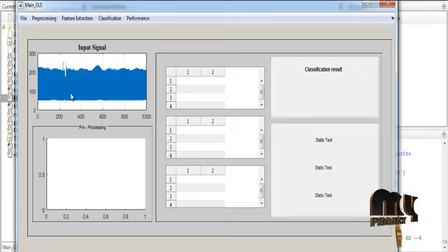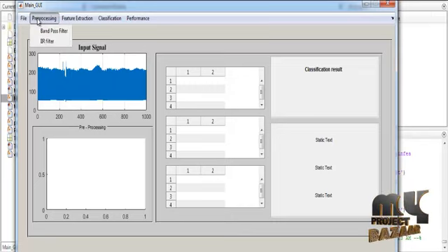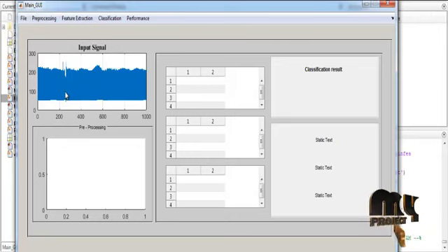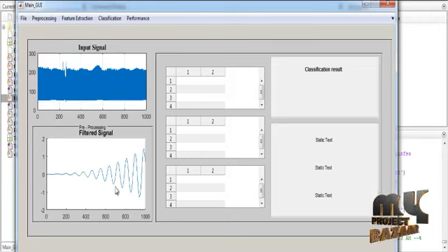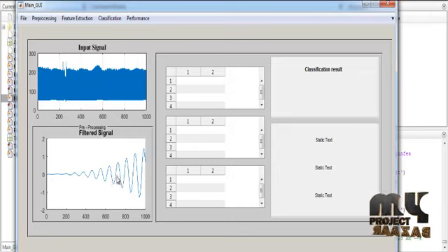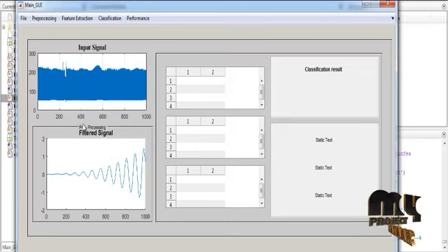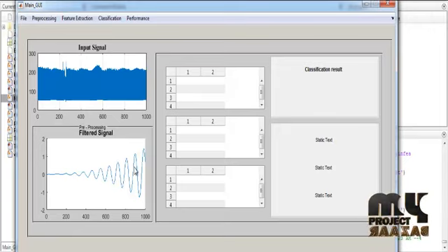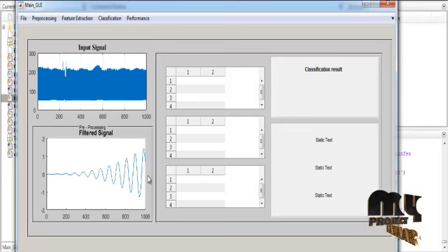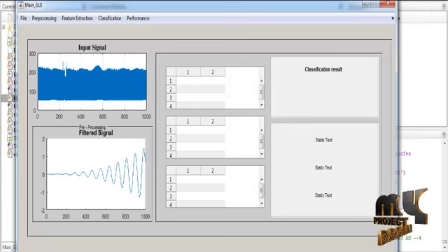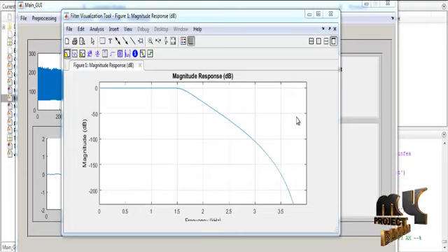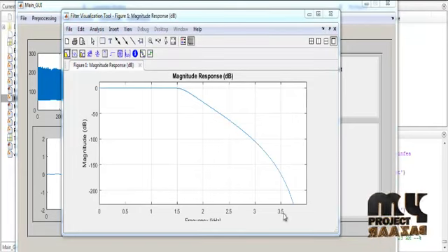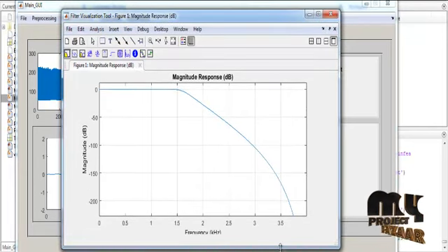After getting the input signal from the dataset, pre-processing is carried out. First, the bandpass filter is applied for the first level of pre-processing. The filtered signal is shown in Axis 2 with the title 'Filtered Signal'. After bandpass filtering, IIR filtering is applied. It will take some time and then display the result. The IIR filter signal values are then plotted as a graph in the figure window.